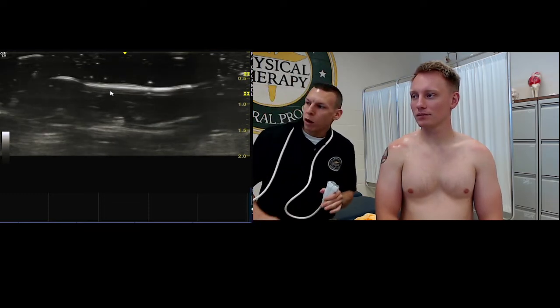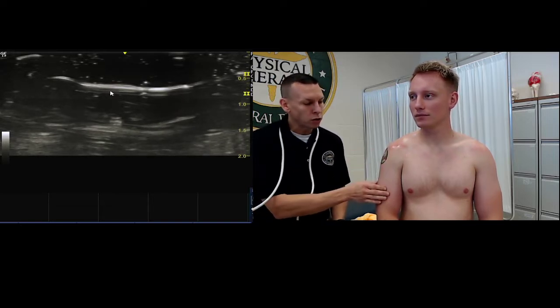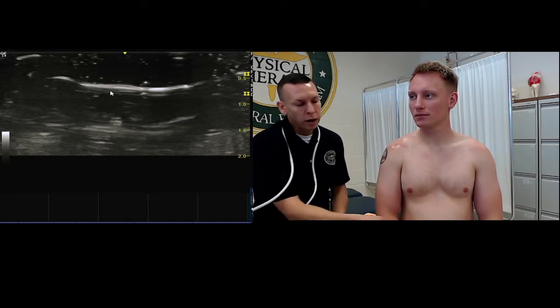Okay, welcome to the shoulder scan along video. We're going to start with your patient just sitting upright, and we're going to take their hand.